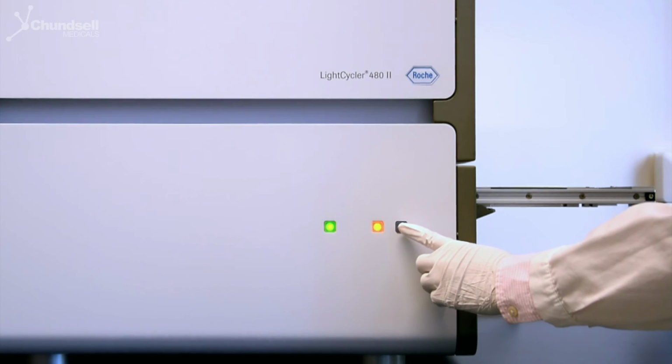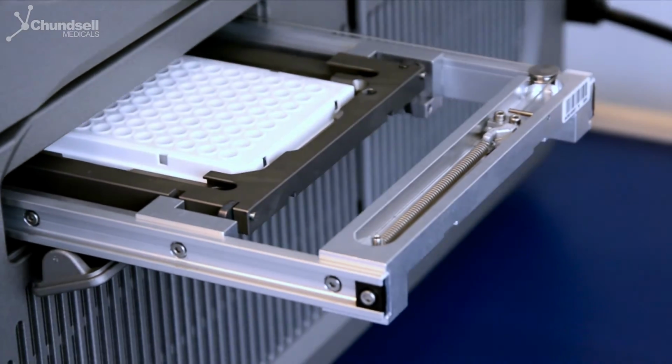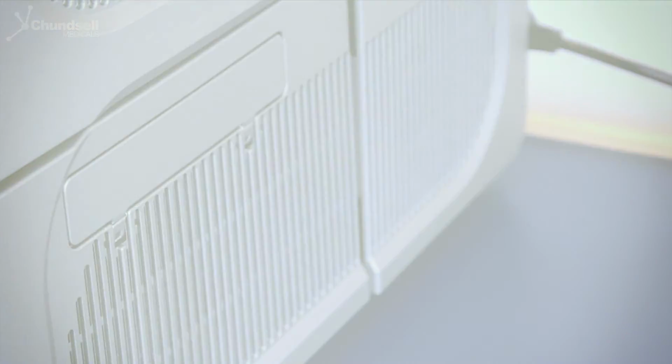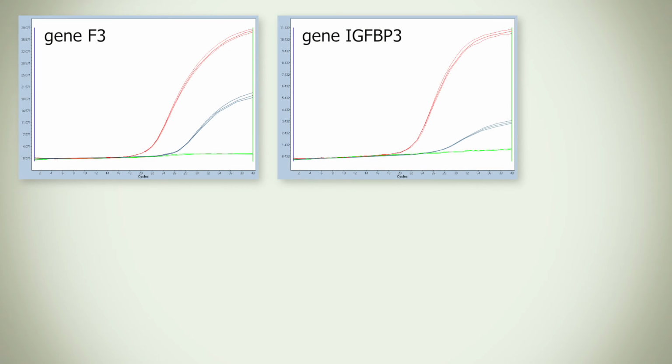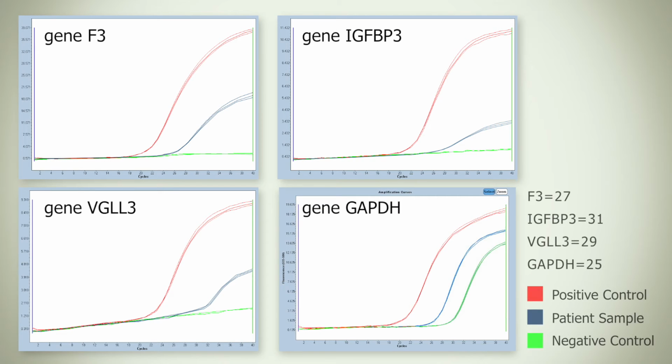Light Cycler 480 Generation 2 is a recommended qPCR instrument, which can perform prostatype tests in a well-controlled manner. In order to measure 3 gene signatures and 1 housekeeper gene at the same time, Prostatype RT-qPCR kit developed as a multiplex RT-qPCR test.